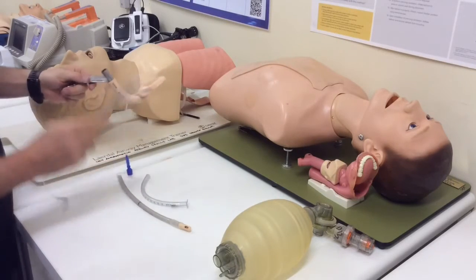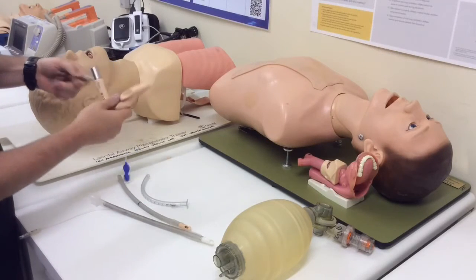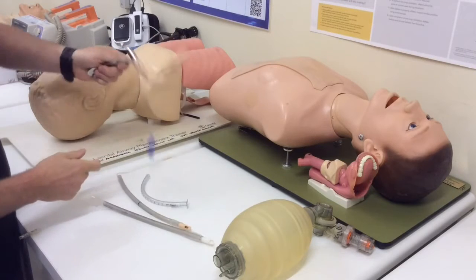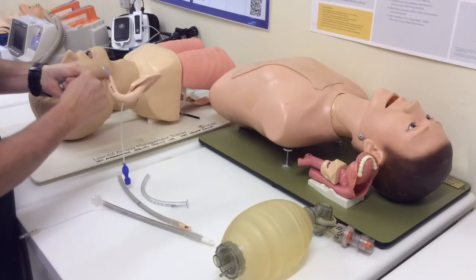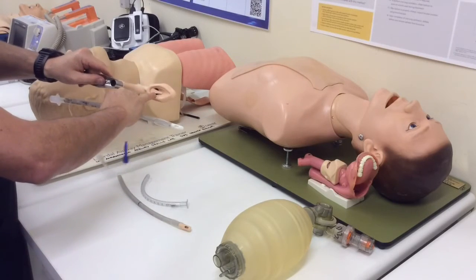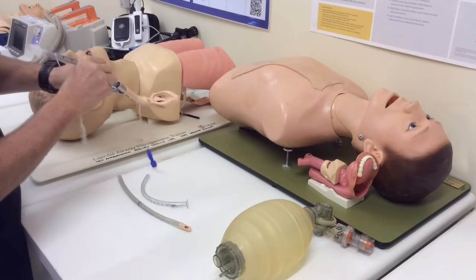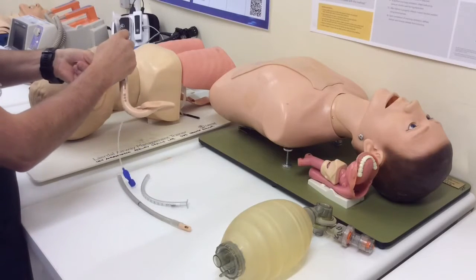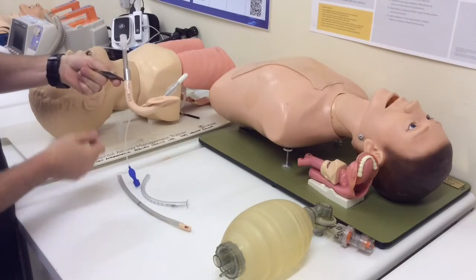The specific features of the supraglottic airway portion of the Fastrach, you can see it's got a rigid handle which allows me to manipulate it, which will be clear in a moment. It's got this sort of J shape and a very specific fixed curvature. It's got an epiglottic lifting bar which helps to lift the epiglottis out the way as the endotracheal tube comes through it. And it's designed so when the endotracheal tube comes out, it comes out at a specific angle to go through the glottic opening.